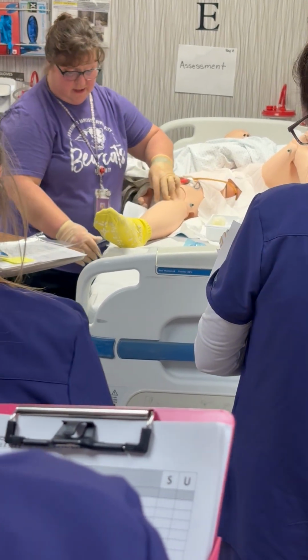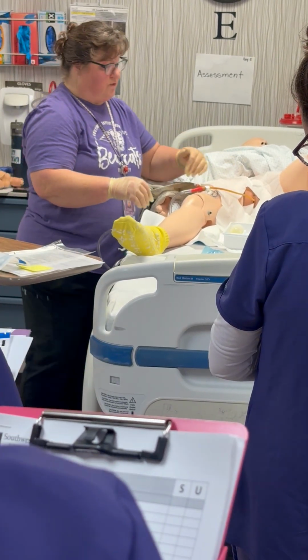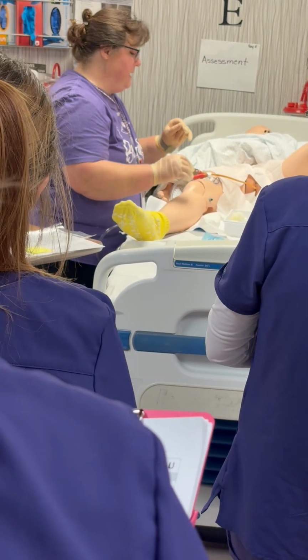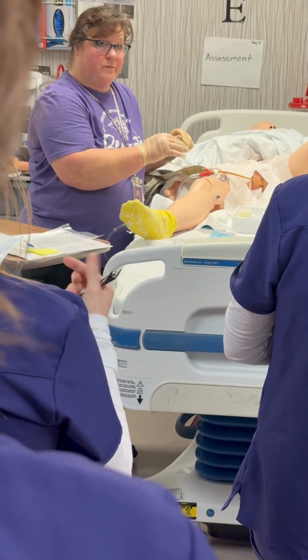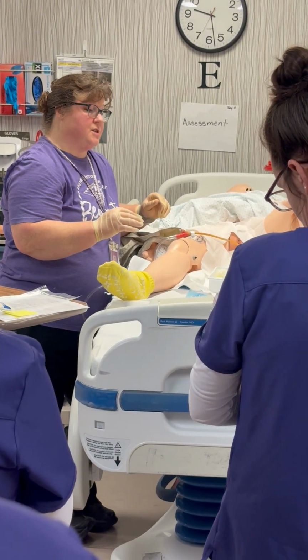I try to make sure that this is not kinked or coiled so that it has a nice flow. I get urine if I need to get urine, and then I can clean this all up. So I will clean it up, and I'll do pericare again because she has betadine on there, right? Okay, so now I'm doing my pericare again. I'm taking away all my trash and everything.